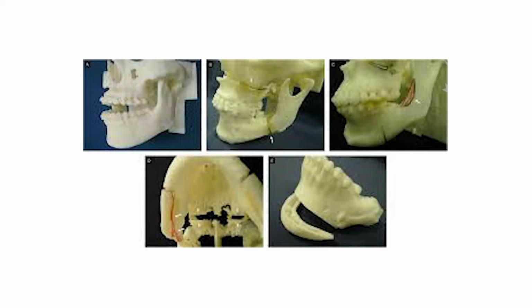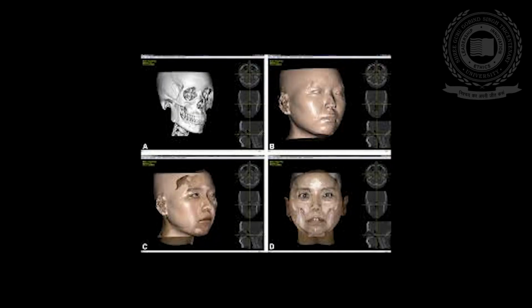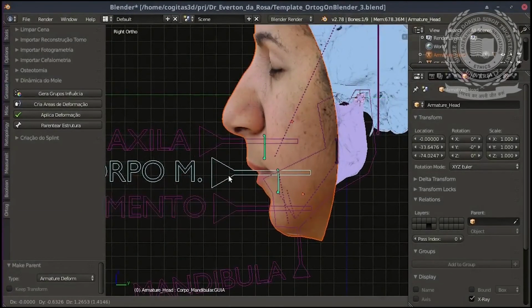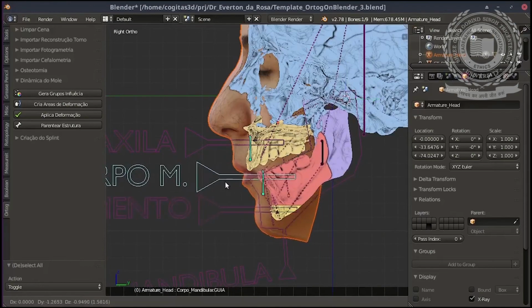These models are employed for mock surgeries of numerous complex oral and maxillofacial situations like trauma, tumor resection, distraction osteogenesis, and more commonly dental implants. CBCT and stereophotography are two of the latest imaging modalities available for three-dimensional visualization of craniofacial structures. CBCT images can be fused with extraoral facial or intraoral optical data.